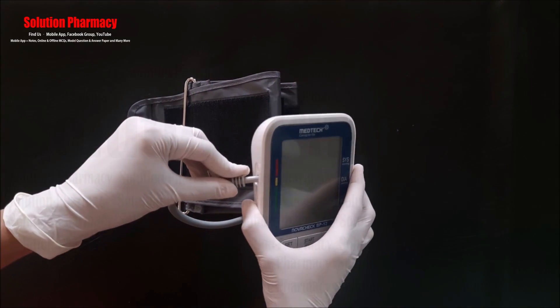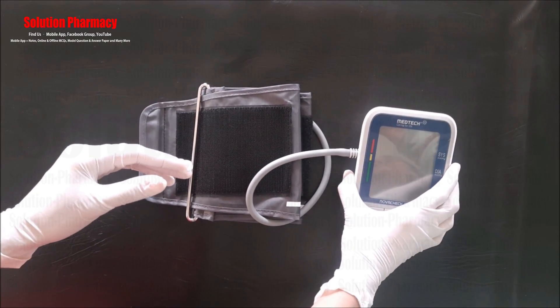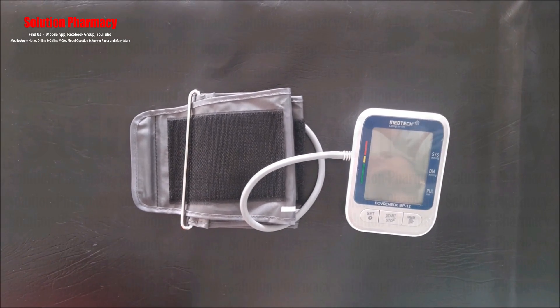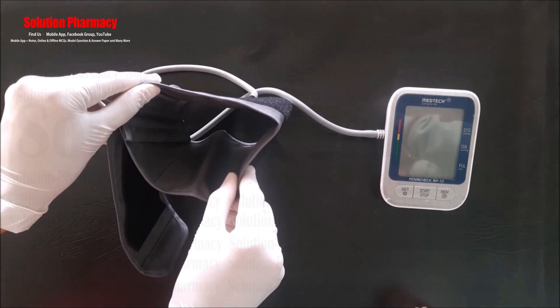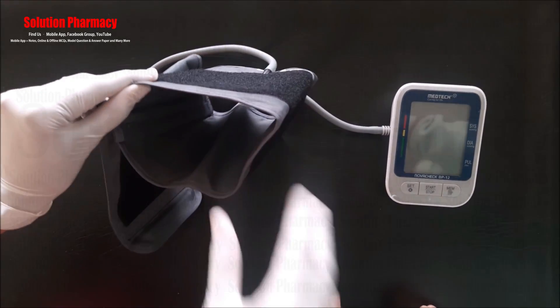To measure blood pressure, first plug the cuff connector into the cuff socket on the left side of the device. At the time of measurement, ensure that the smooth surface is on the inside of the cuff loop and the metal ring does not touch the skin of the person being measured.